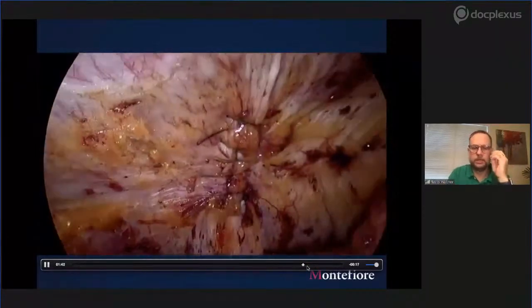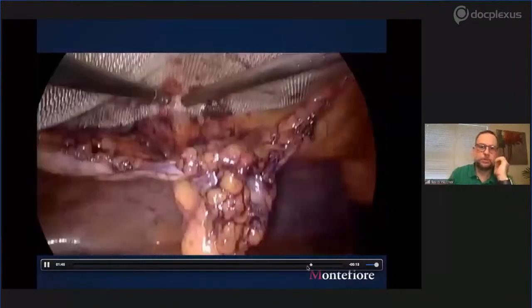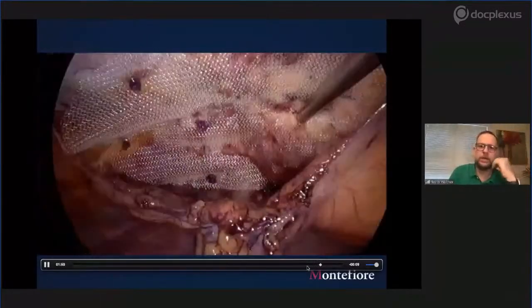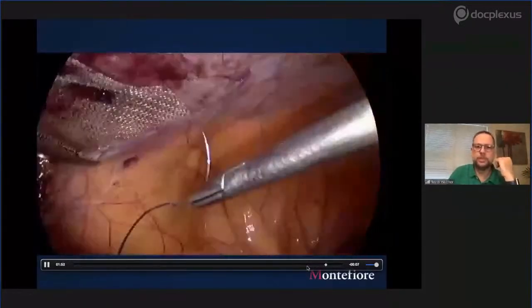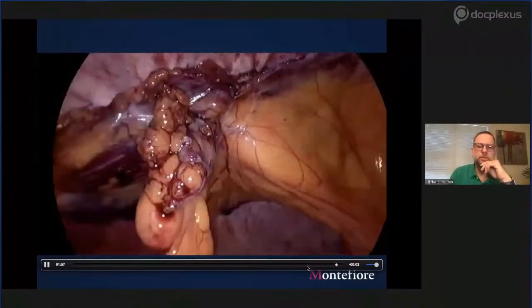It's more laborious to do by laparoscopy, and in his case he just put a traditional polypropylene mesh. You can do tackers, or you can do just cardinal sutures and then just close. This is really a difficult step in the procedure. Cristiano is a lefty. He's a left-hand surgeon, but he really can operate with both hands and is a very skilled surgeon.